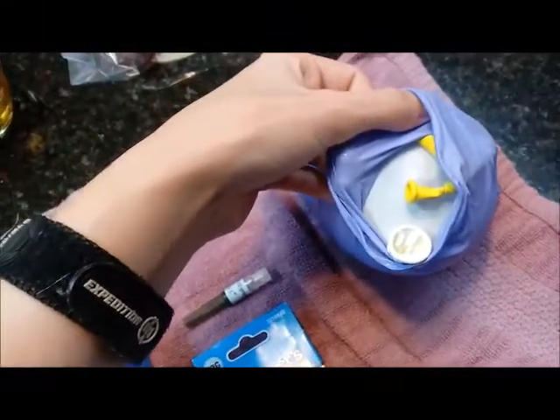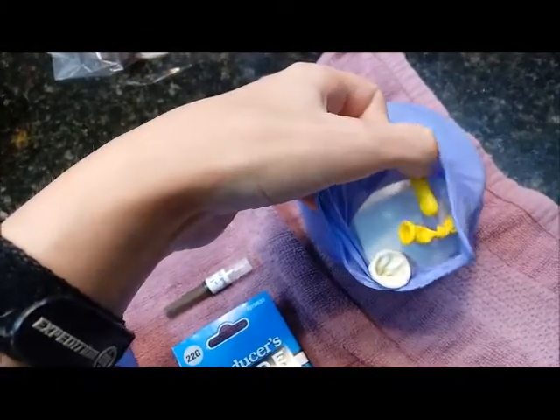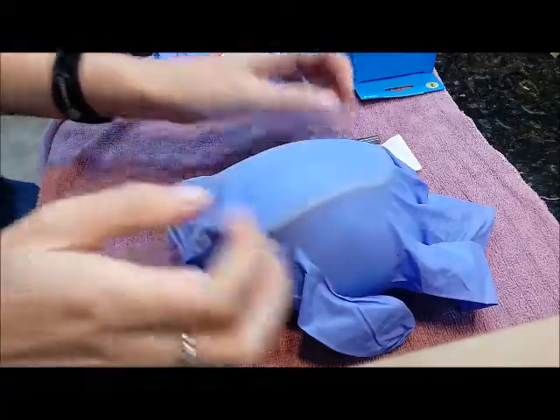You can see I've filled up the balloon with water — the regular balloon — and then I filled up the little long balloon with dish liquid so you can tell when you hit it. Here I have my little balloon set up.